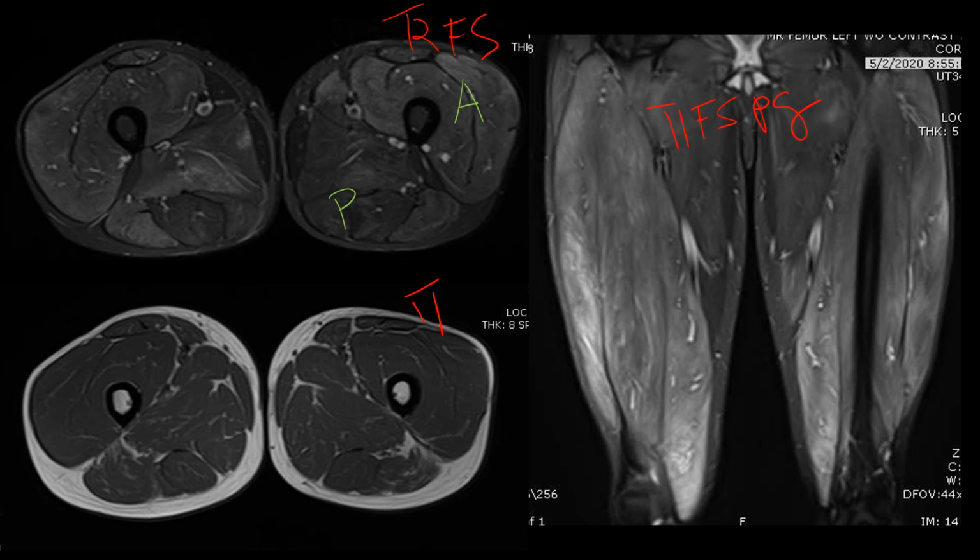There's really not enough atrophy to see fatty infiltration, but in the post-gadolinium images, we see that there is a diffuse patchy enhancement throughout the muscles. So we have edema and enhancement of the muscles. Patchy, there's not really a localized region of enhancement that would suggest a mass or a focal inflammation. So this is just diffuse inflammation, and we're thinking about myositis, obviously inflammation of the muscle, in a systemic process, and we see this commonly in dermatomyositis and polymyositis.